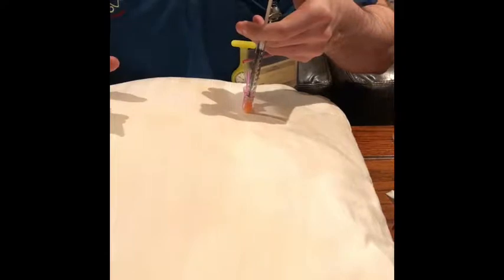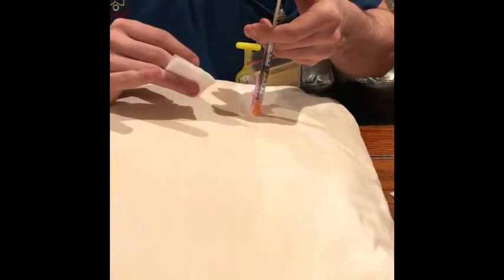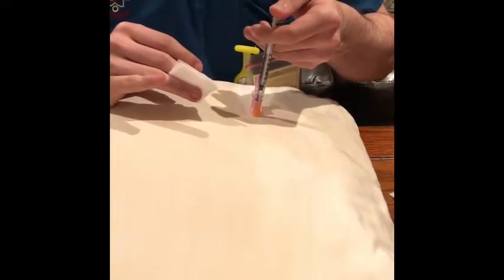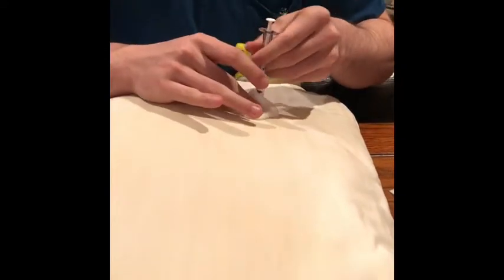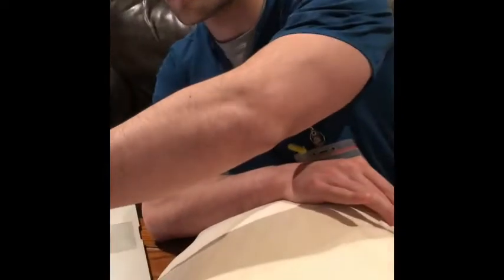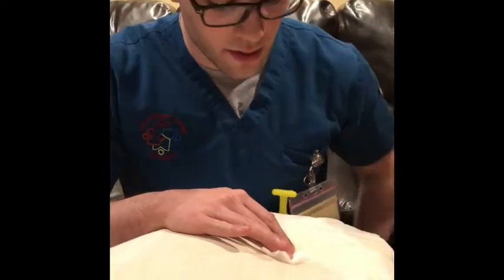Administer the medication slowly, ready with gauze. And then I would highlight the gauze there and pull away from me. I would dispose of the needle in the sharps container. Then I would hold the gauze here for the allotted time.